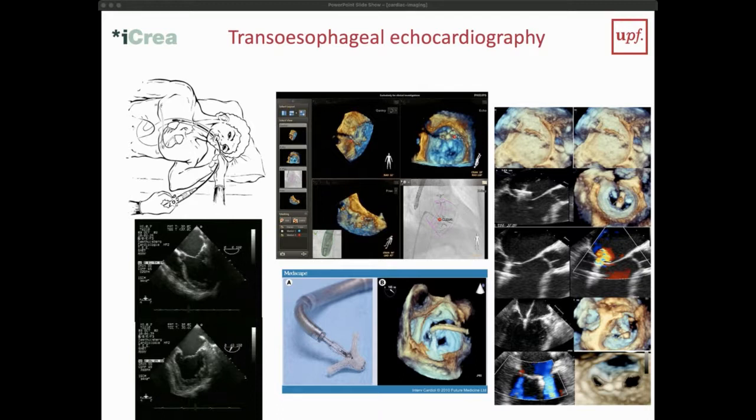And so if we really need to look in more detail, and especially if we do some complex surgery, for example, where we want to do real-time monitoring, what we can do is use transoesophageal echocardiography. What we do there is bring the probe, which is now at the end of an endoscope, we let the patient swallow it, and we go through the esophagus, and we can even put a transducer into the stomach to be able to do imaging from very close by.